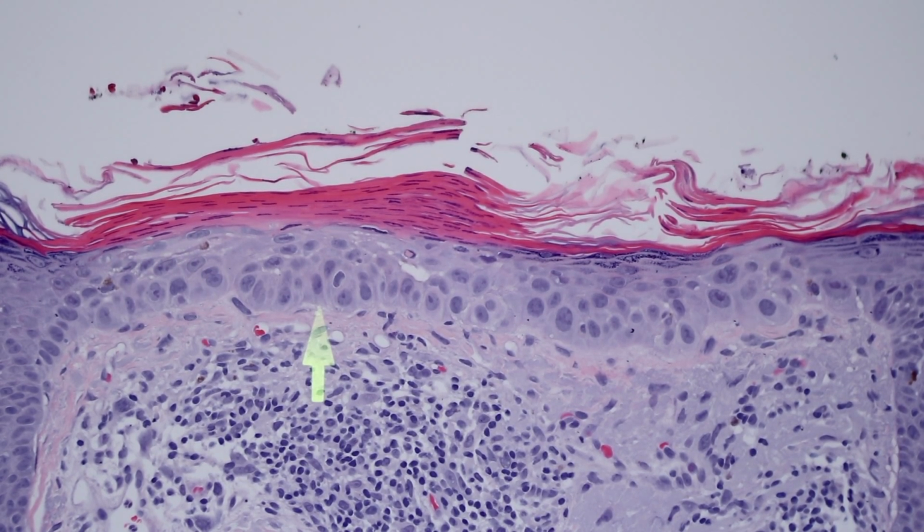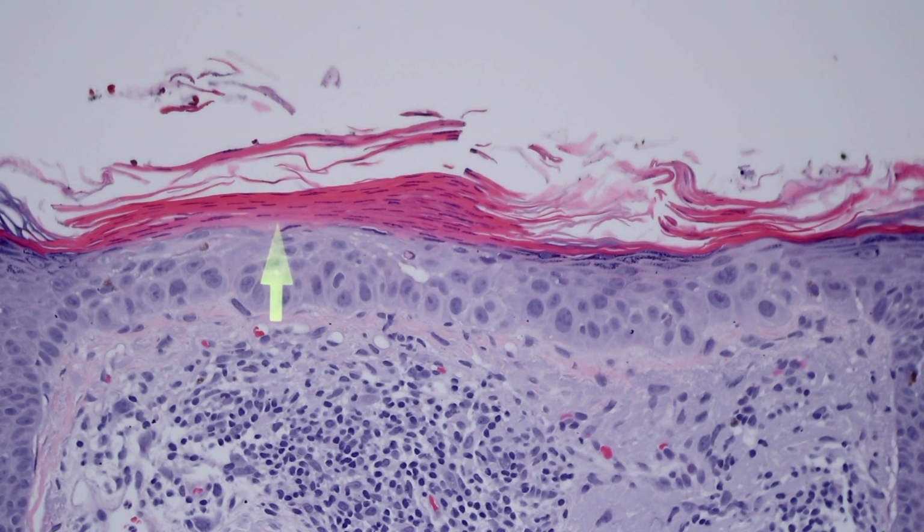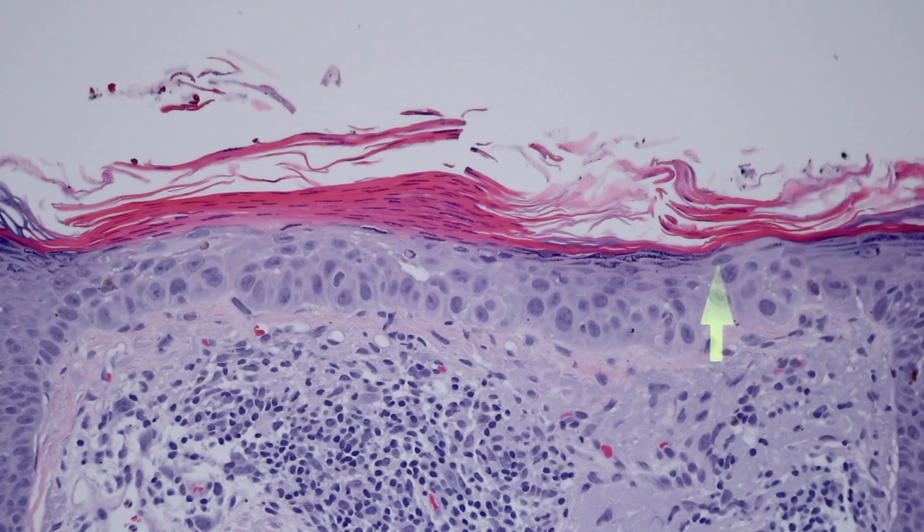Now that might sound simple, but in real life practice that can actually become quite challenging. Especially here, look, the whole epidermis is what, 5 cells thick? So there's an atypical cell at the top. Is that squamous cell carcinoma in situ? What about over here? There's one atypical cell getting all the way to the surface. Is that in situ? So it can actually become a little bit subjective. I think you just have to look at the whole lesion and make a distinction based on the gestalt, the overall appearance, and also how big the biopsy is and what your level of clinical concern is.